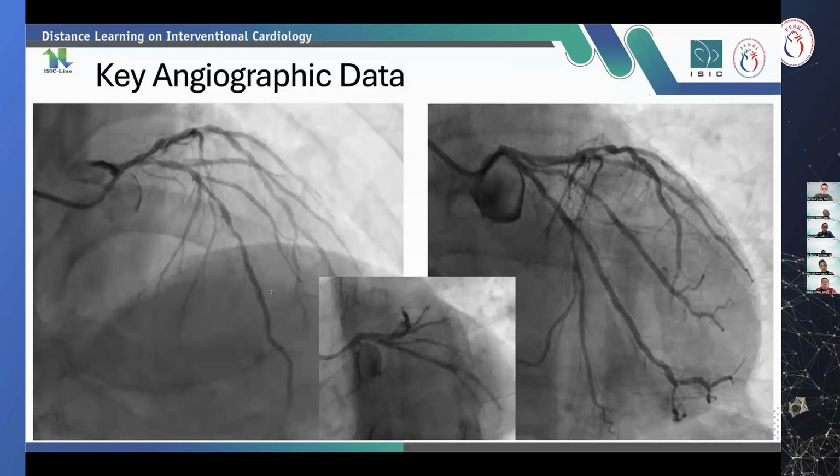But what Dr. Fauzi mentioned, should we do this directly? I don't think so. This is a complex coronary angiogram. So we need more data, whether we have to decide what should we do in this part of complex long lesion. Maybe other consideration, keep it still the option, but if it is not approved by the patient for the CABG, I think that we have to really be careful whether we should put a very long stent in the LAD or the circ, and also goes to the left main. So we need more data.